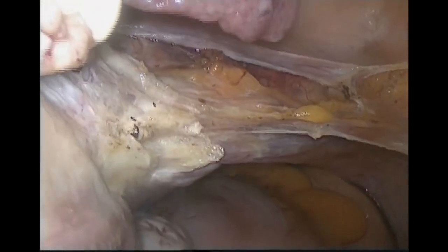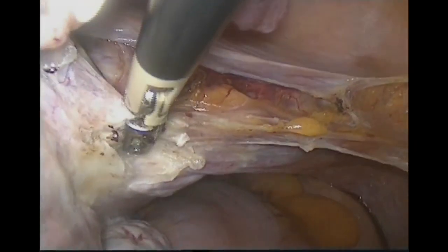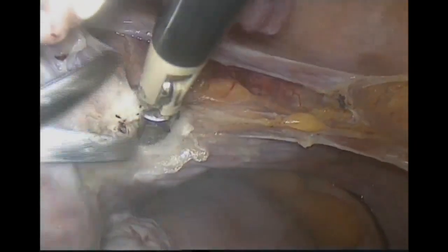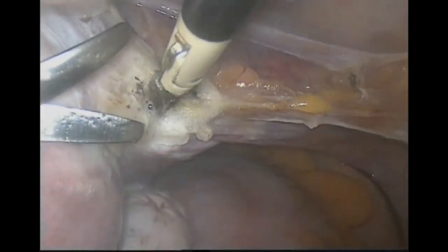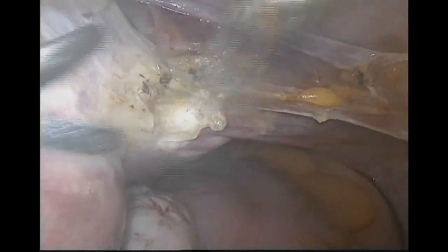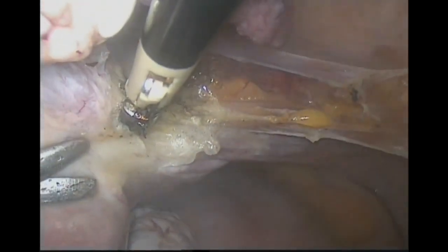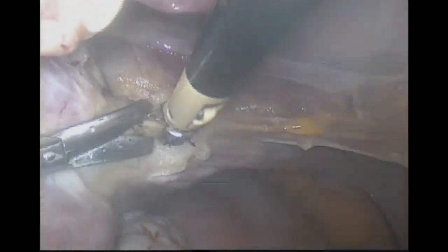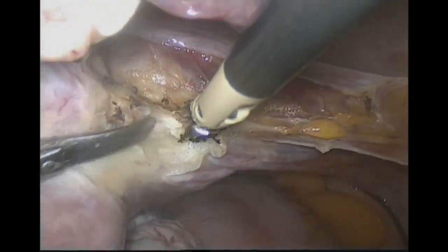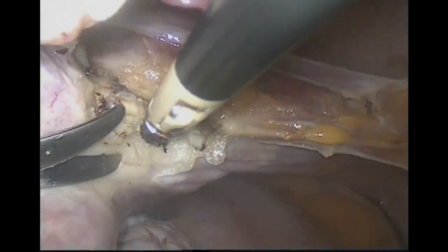Go vertical toward the uterine artery, as you see, with the simple classic bipolar and cold scissors. Take the blood vessels, coagulate and divide them at the level of the internal os, medial to the colpotomy rim, please, which lateralizes the ureter. The cup does the ureteric dissection.